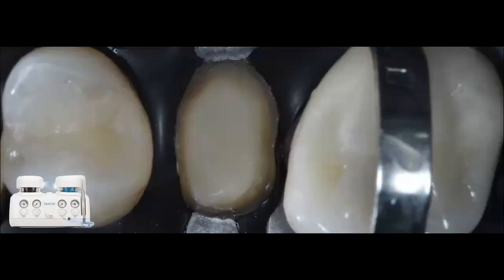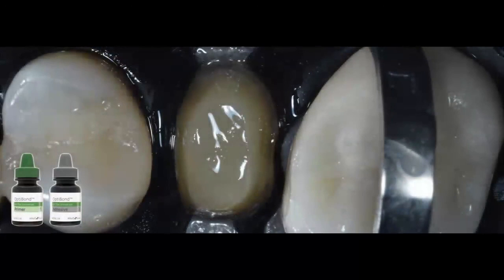Then I come back and I use the AquaCare again, and I clean and I create very small porosities on this core buildup, so that there's better interaction between the resin composite that I'm going to use to cement and the core buildup. And how do I do that? Again, using the same AquaCare 29 micron aluminum oxide 1.5 bar combined with distilled water. And then I apply both primer and adhesive, just like I shared with you previously.